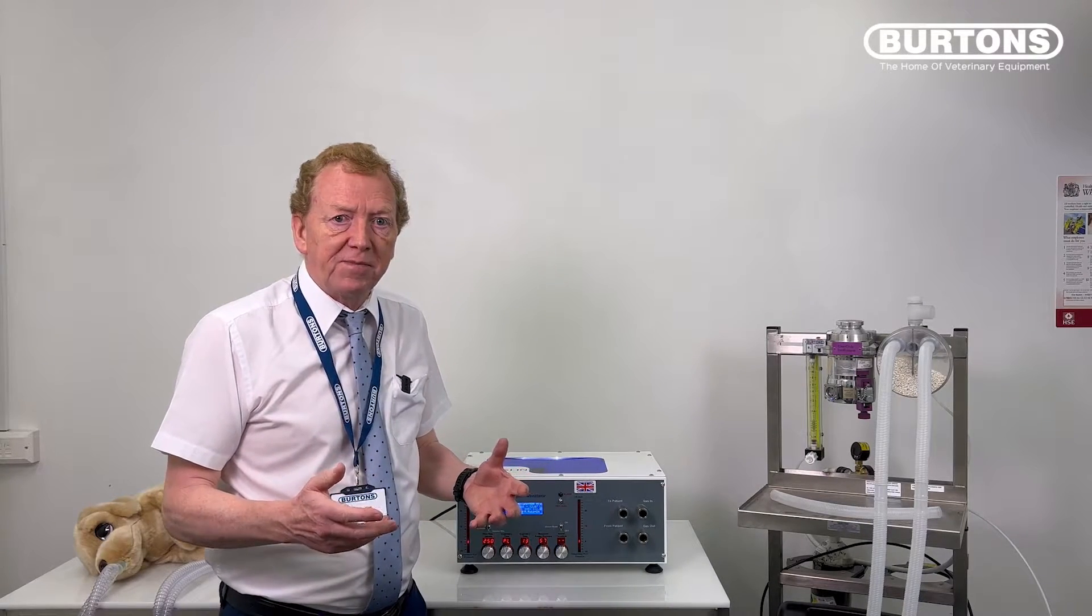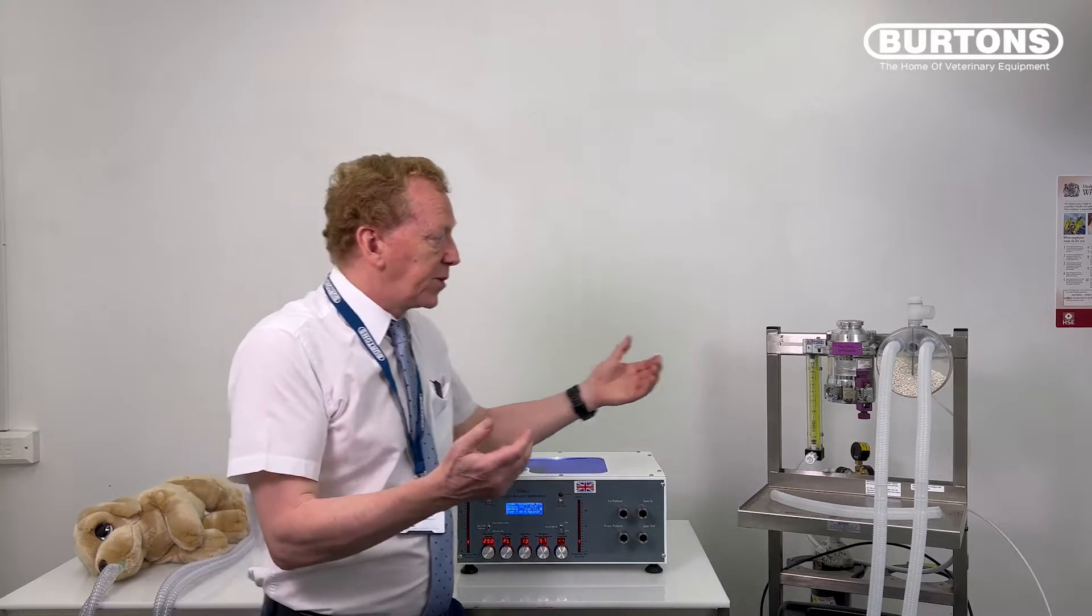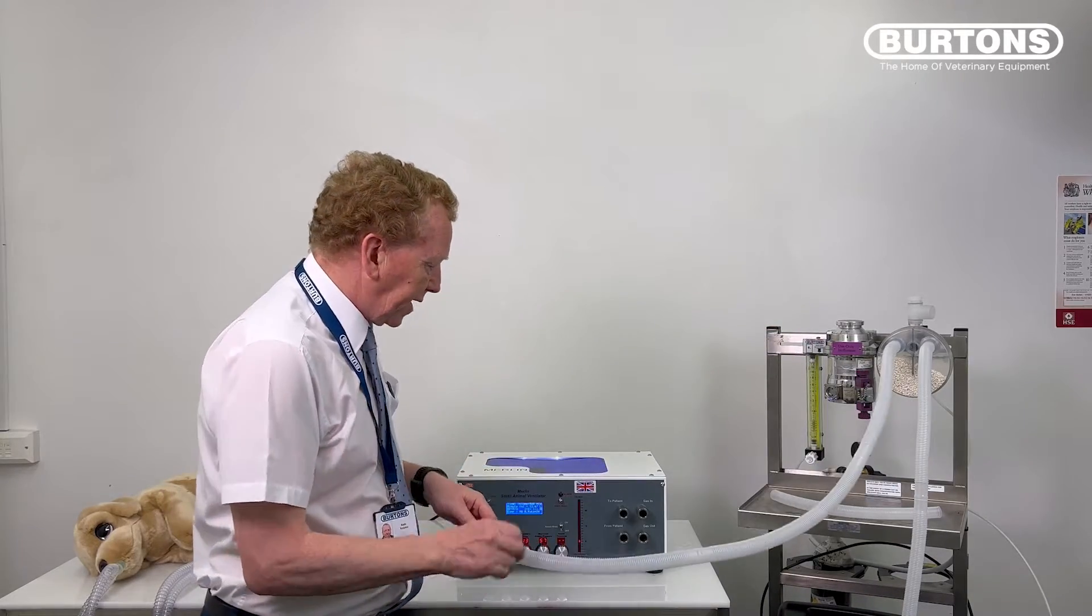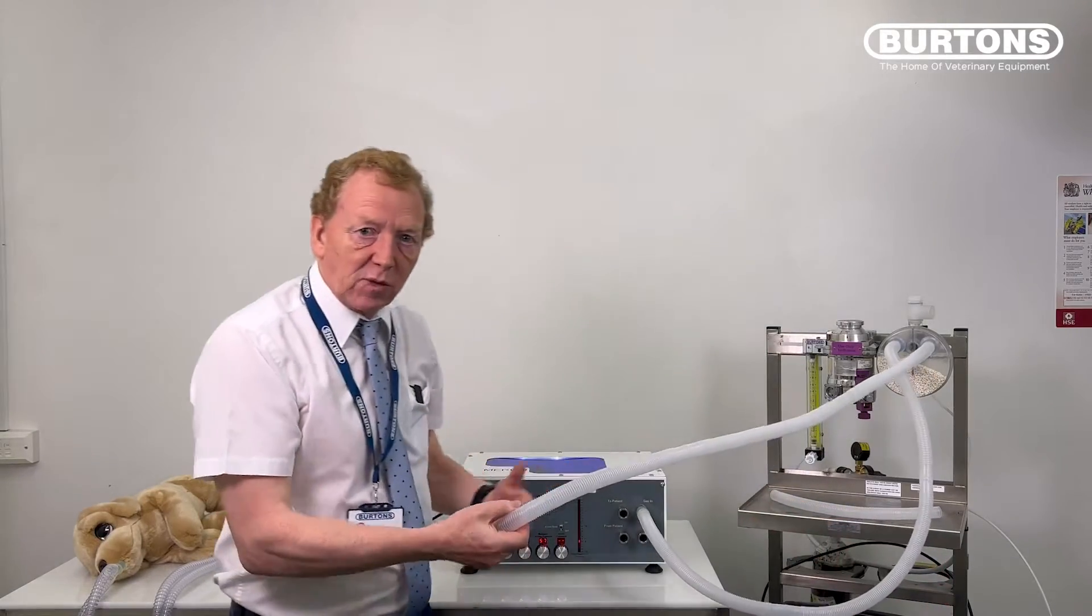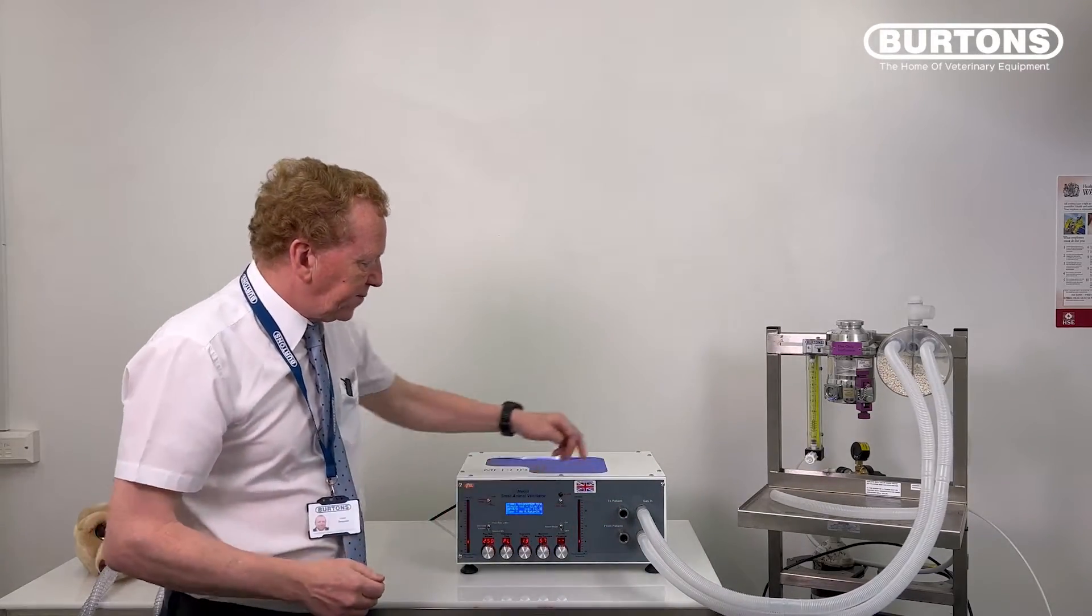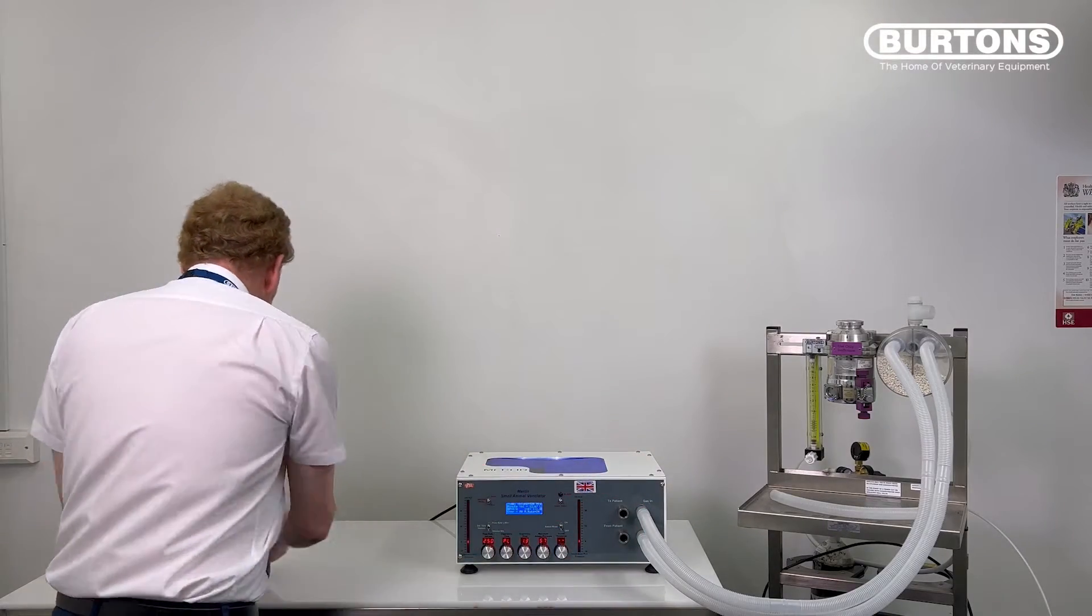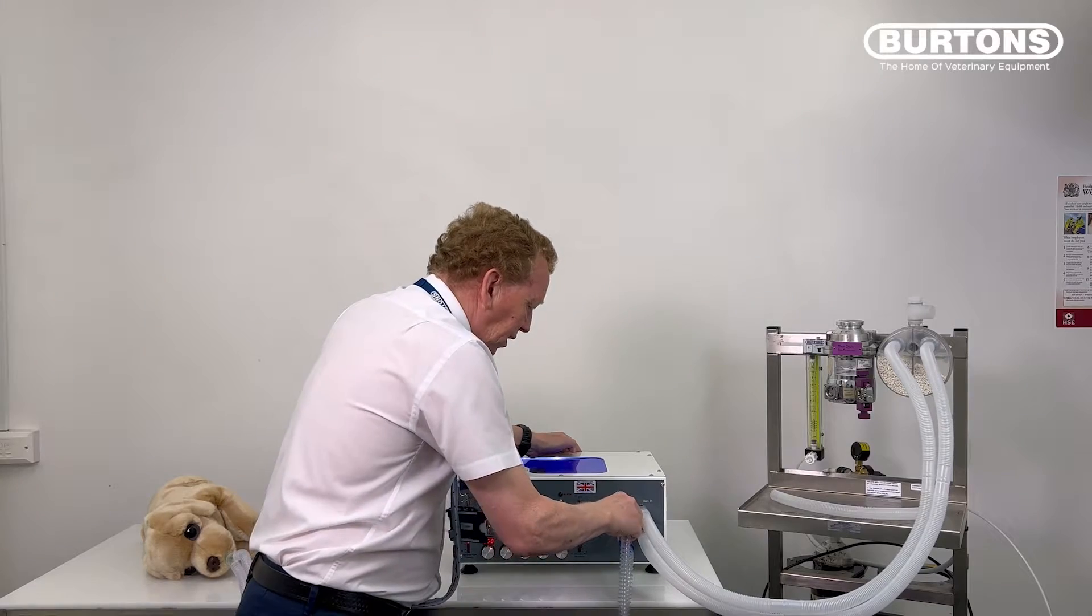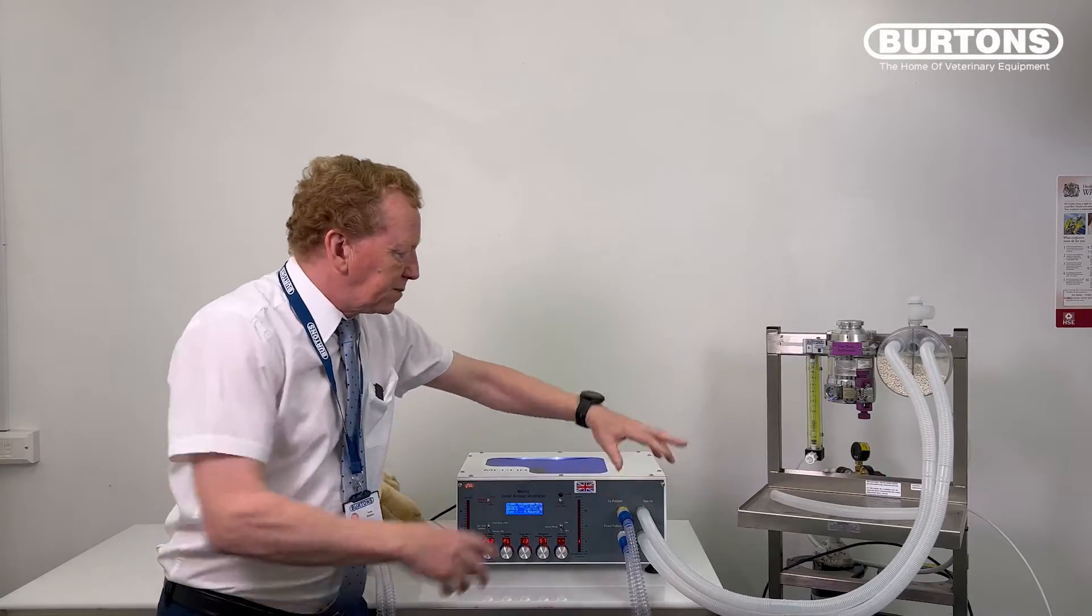We'll start with the rebreathing system. It's very simple to set up. We're going to take the inspiratory limb from a suitable circle system and put that into our gas in. Then we're going to take the expiratory limb that would take the gas away from the patient normally and take that out from the gas out. As you probably remember from other videos, internally that is connected to that and that is connected to that. So if we put a patient system on here, then we put that to that and this is running down to the patient. What we've really done is just made this a long tube.